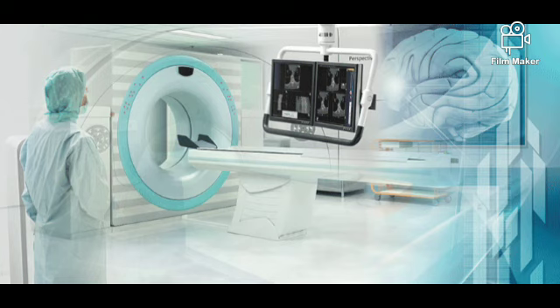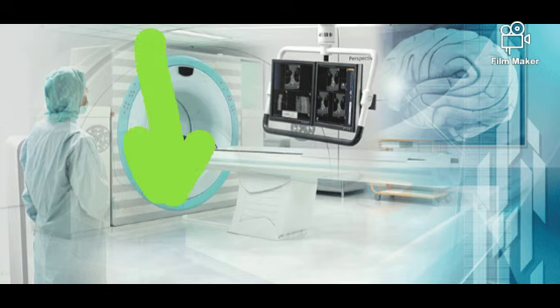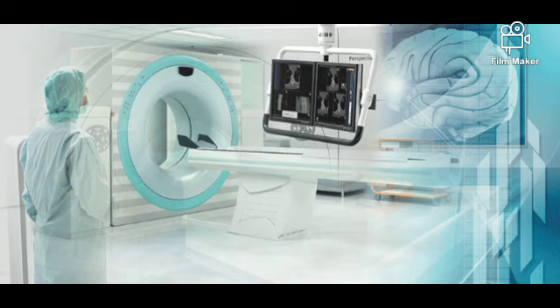In this acquisition system, an operator can stay inside the scanner room, and he can see from there itself what is happening inside the patient's body. He can do adjustments also. There is a joystick function also available in this type of acquisition system.